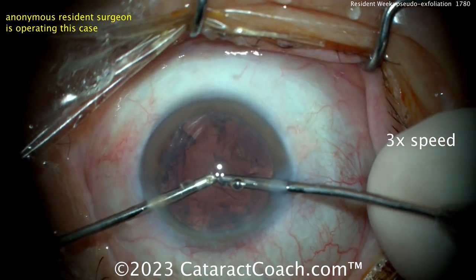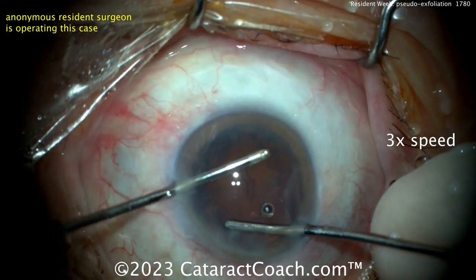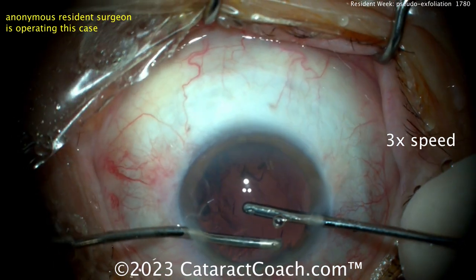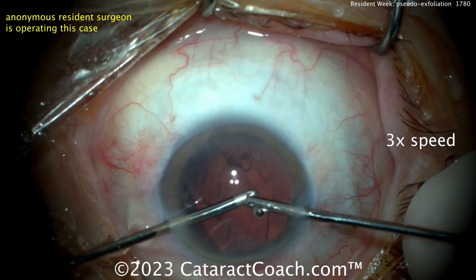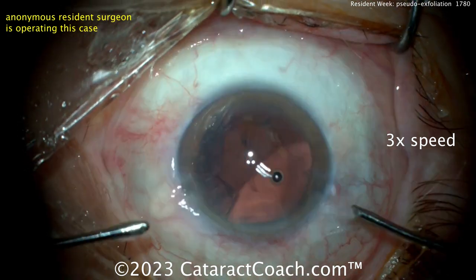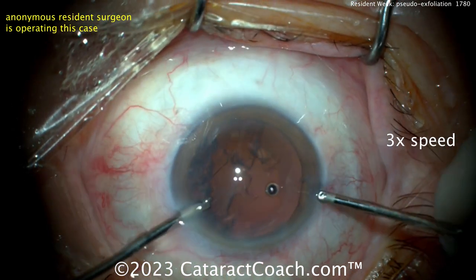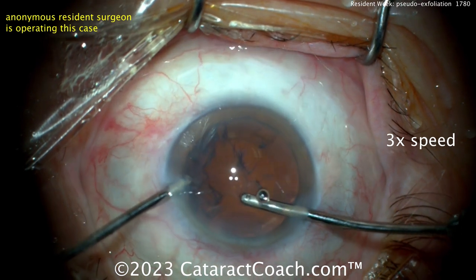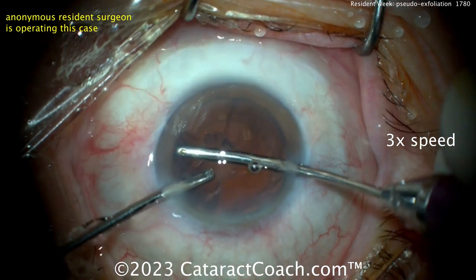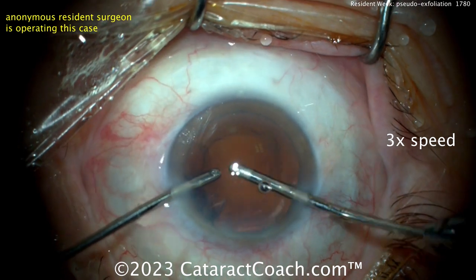Let's see bimanual cortex removal. Doing it radially is okay, but you're going to have to pull many little strips radially one at a time. Whereas if you go circumferential, you'll be able to get a few clock hours of lens cortex at once — so it'll be a lot more efficient. Try circumferentially instead of pulling radially. Those pieces come up pretty nicely — very nice.